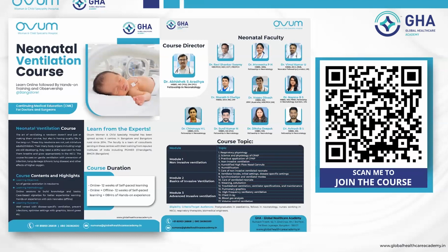Apart from this, there are some new machines coming called NeoVent, which converts a bubble CPAP to an NIV. It has a float. The float goes up and down, and then you can generate two pressures. You can give BiPAP or NIV with a bubble CPAP machine. So these are some innovations, and maybe more work is required before they become routine.